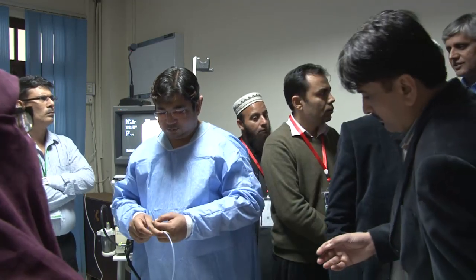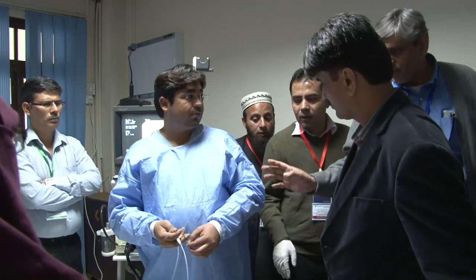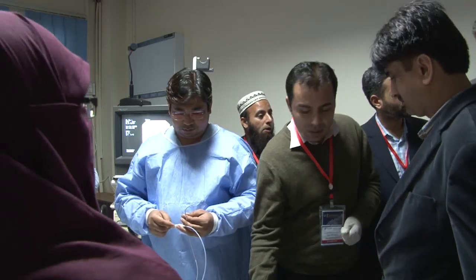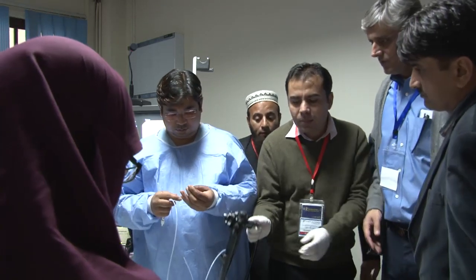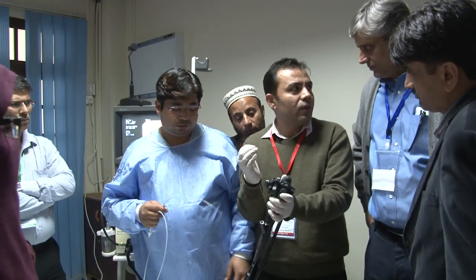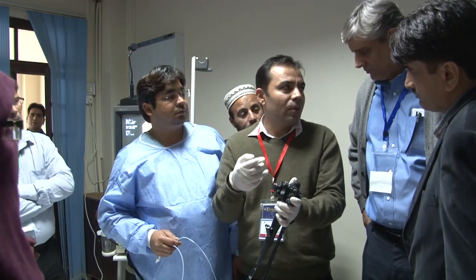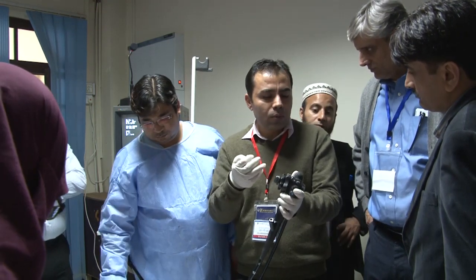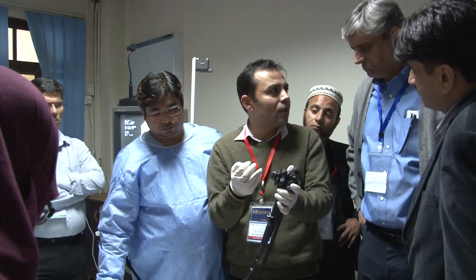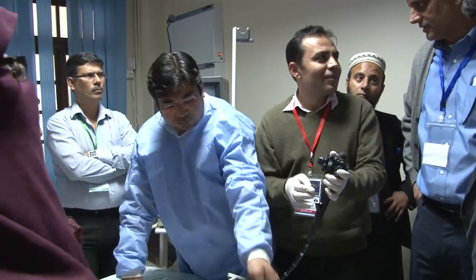आपने करा, स्टेंट डालो ना इसे, अब स्टेंट अंदर डालो इसको. दूसरा चक्कर ये कि sphincterotomy before sphincteroplasty. ये ब्रिज जब हम स्टेंट रिलीज करते हैं, अप करते हैं, फिर थोड़ा सा पुश करते हैं, तो अक्सर डिफिकल्टी होती है स्टेंट डालने में, ब्रिज का. जब आप अप करते हो, जरूरत नहीं पड़ेगी. ज़्यादातर केसेस में जरूरत नहीं पड़ती.